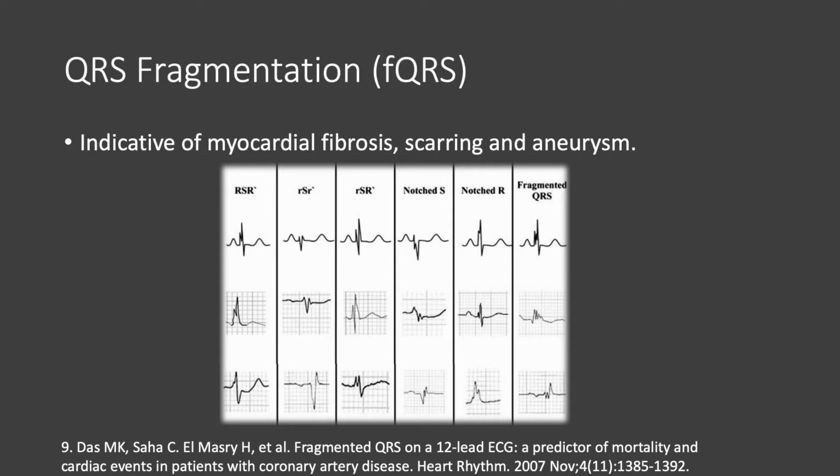They retrospectively analyzed more than 1,000 patients in their VA hospital, and as we just discussed, it was already known that bundle branch blocks are associated with higher overall mortality rates. Therefore, they excluded all patients with typical right bundle and left bundle branch block with QRSs over 120, as well as patients with incomplete right bundle branch block and a QRS duration between 100 and 120 milliseconds. Then they categorized different fragmented QRS morphologies into 6 different categories, which I've shown here.